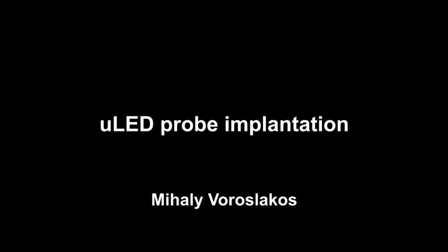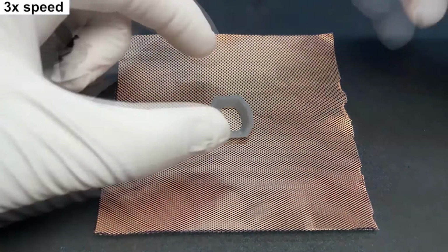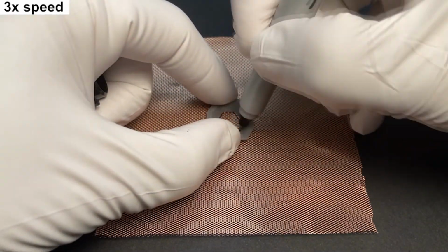And the next step is the surgery. And before surgery, there is still one more preparation that we need to do. So previously we used anchoring screws, but now we replace those with other methods.